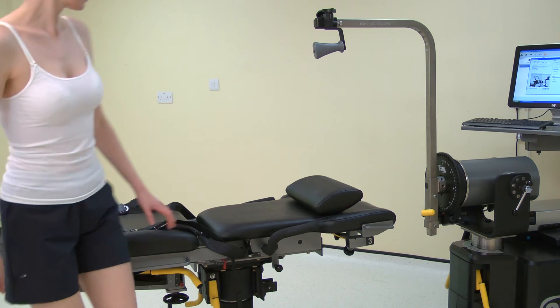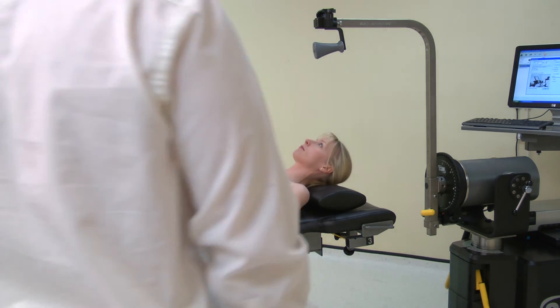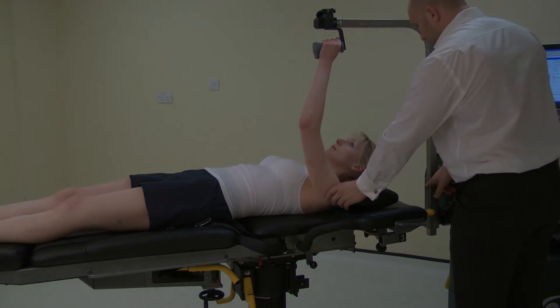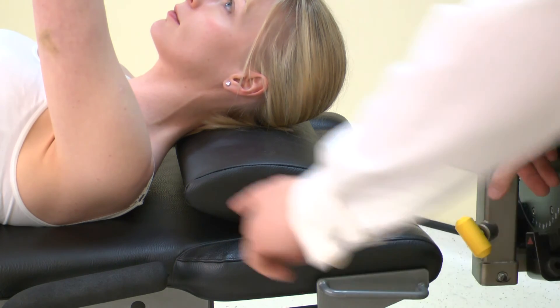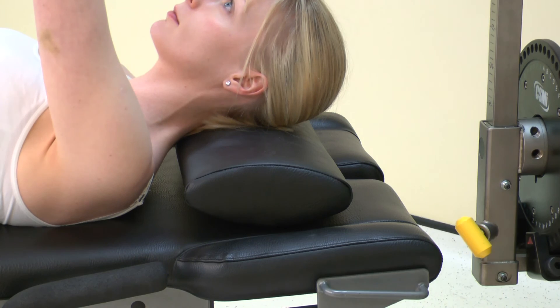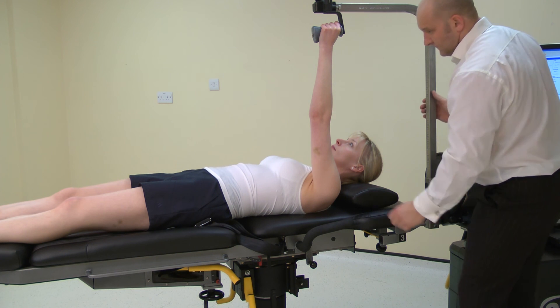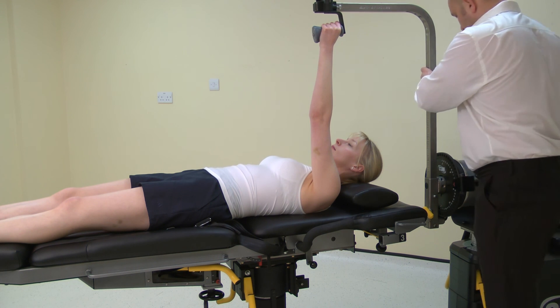Once the norm is positioned, ask the subject to lie on the chair. Adjust the monorail to position the arm, allowing 90 degrees shoulder flexion under the hand grip. Now the axis of rotation needs to be set. The axis for the joint needs to be directly opposite the black dot on the input arm. The axis of rotation for the shoulder is opposite the acromion. The chair fore/aft and the dynamometer height may need adjustment to achieve alignment. Once alignment is achieved, ask the subject to hold the handle. The length of the elbow/shoulder adapter may need adjustment. Top tip: try to leave the elbow a few degrees from full extension. Now check the axis of rotation.